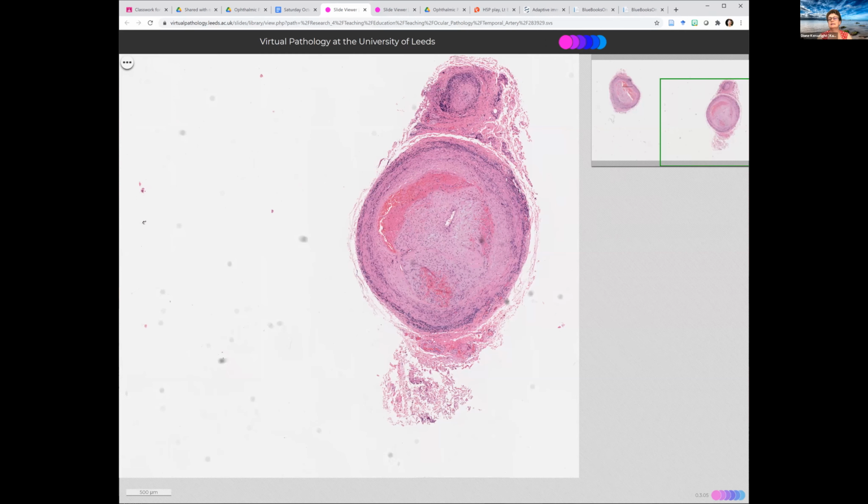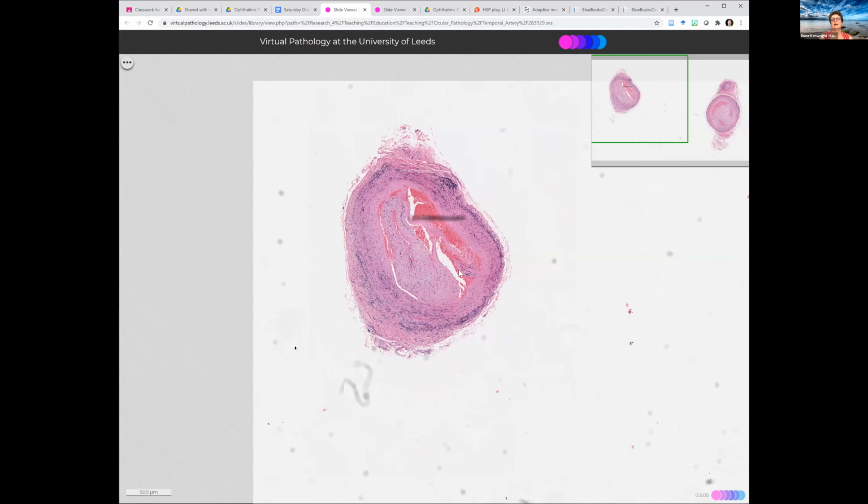I think that's it. So, anyone else got questions? Can you call it thrombus because there are red cells? No, because it's organizing thrombus and it's got hemosiderin. And the giant cells are a bit squashed, so they're hard to spot.